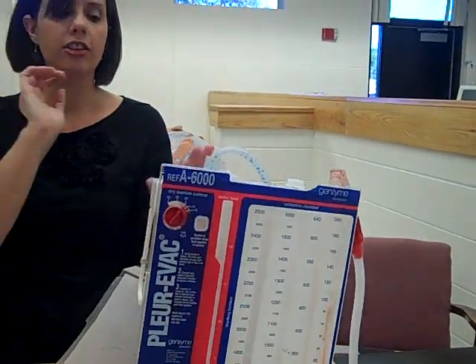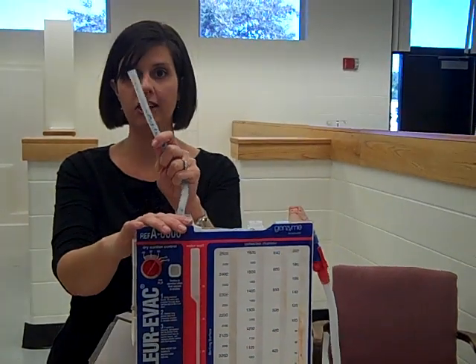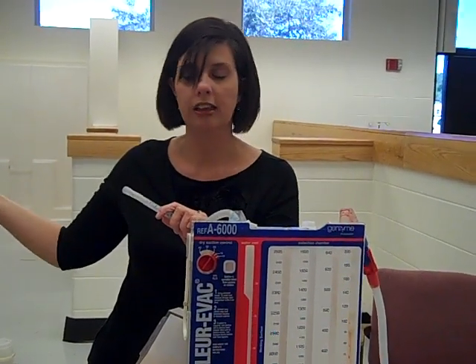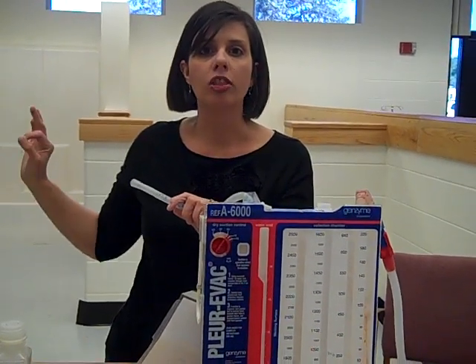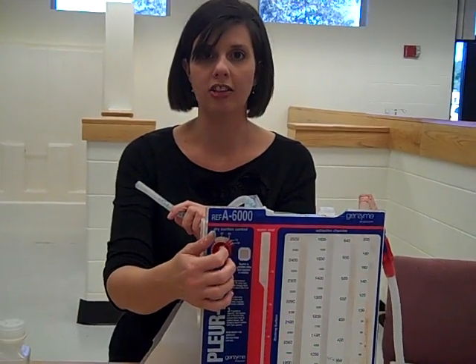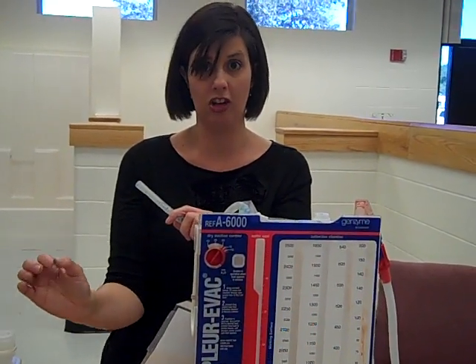Now, once you have this set up, you would take this tubing that you use to put the water in to create a seal. You would hook this to your wall suction, and you would turn on your wall suction to a medium setting, roughly 80 to 120, okay? The amount of suction on the wall does not determine how much suction the patient actually gets. That is determined by this dry suction control dial that we've already set to the prescribed amount that the physician has deemed appropriate, okay? At that point, you are ready to go.